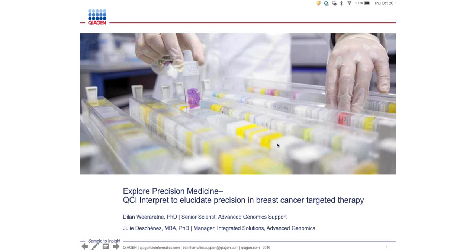In this webinar, we'll explore a few breast cancer case studies using QIAGEN's solution for clinical decision support in oncology called QCI Clinical Insight, or in short, QCI Interpret.